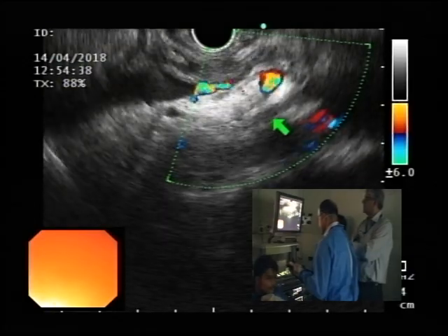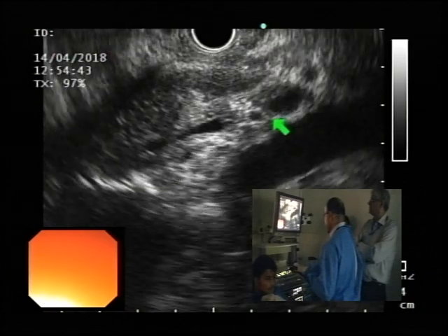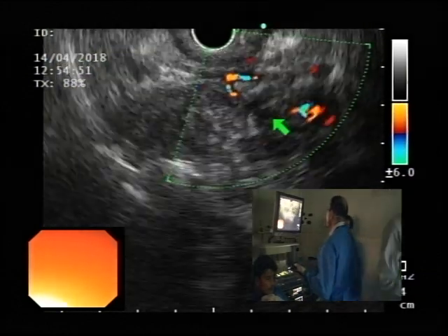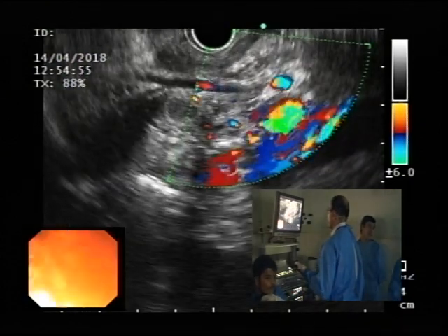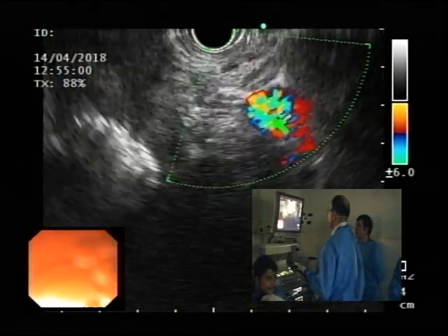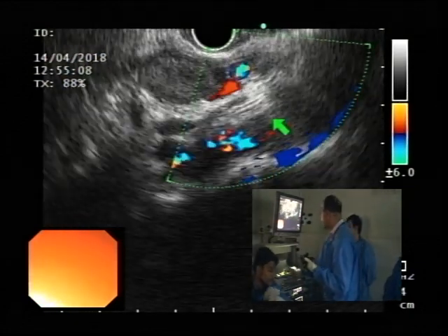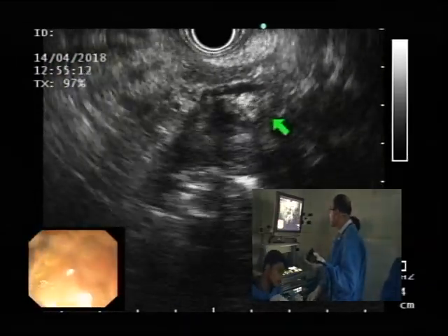I would love to see the CT. Do you see flow in that? I did. I think that's a vessel. Let me just double check. That's not the duct. That is not the duct, guys. It's kind of sad too that we're not able to do this. So that was not the dilated upstream duct, guys, because that was the vessel.